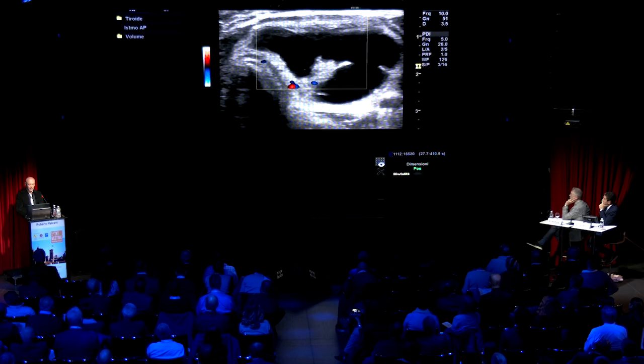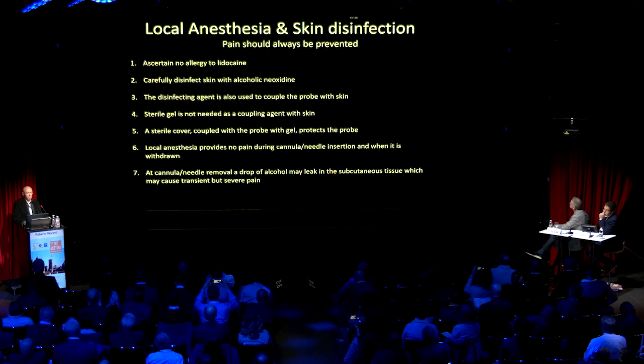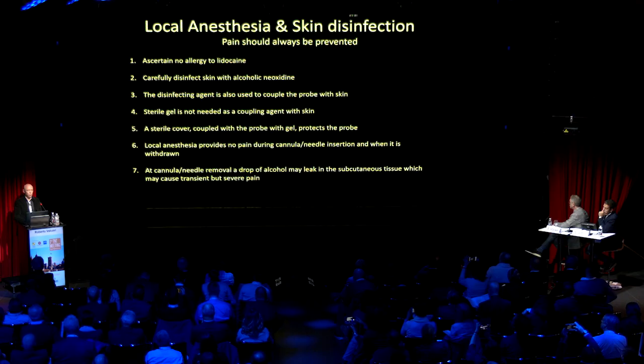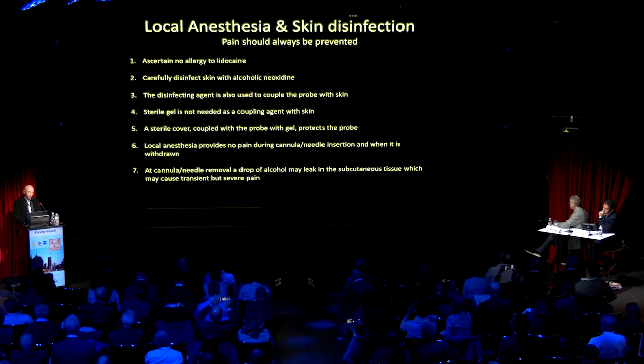With the power color Doppler, you saw the snowfall effect, indicating there is refractive colloid inside the pseudocyst. Again, I will stress that painless procedures are by far preferred by our patients. This is why I suggest performing a minimal 2% lidocaine anesthesia in ethanol ablation too, because, and of course, skin disinfection is also important.